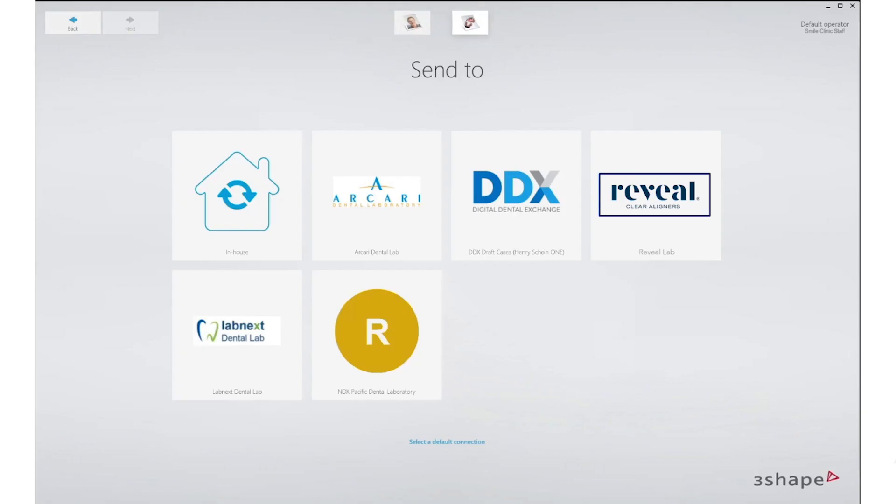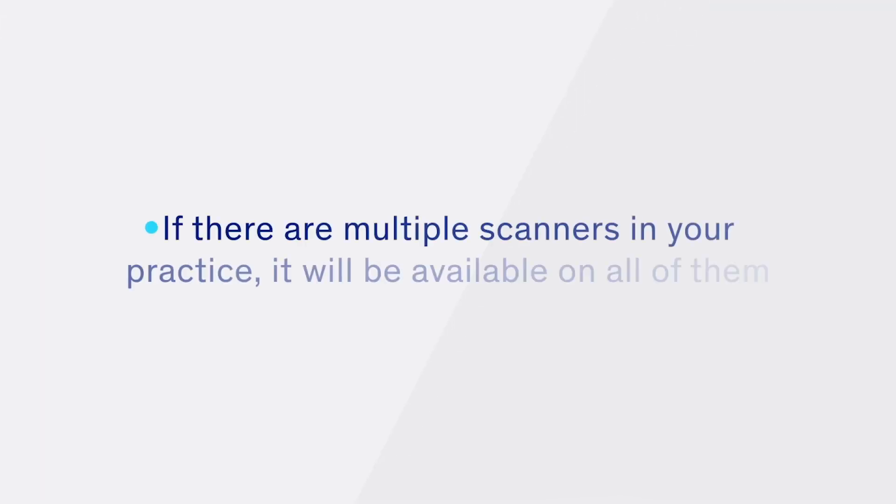The Reveal Lab account will now show up as a lab on your practice's TRIOs. If there are multiple scanners in your practice, it will be available on all of them.